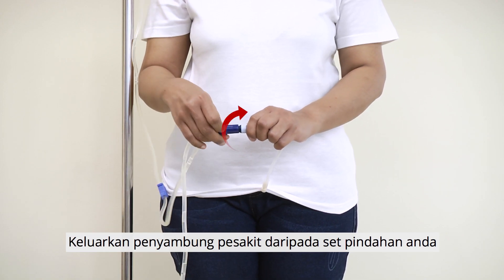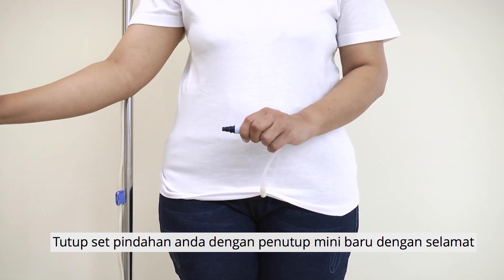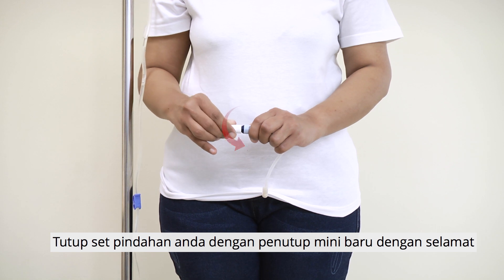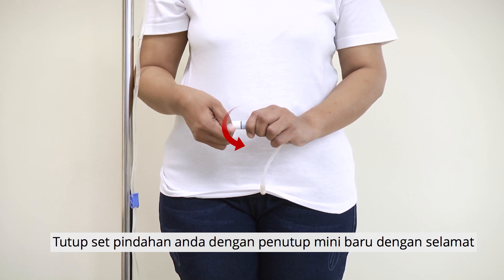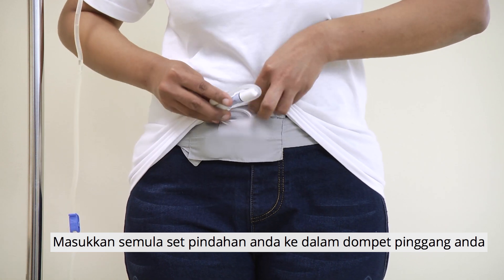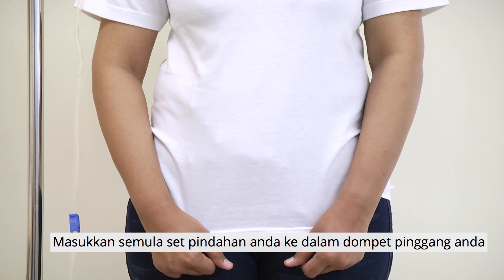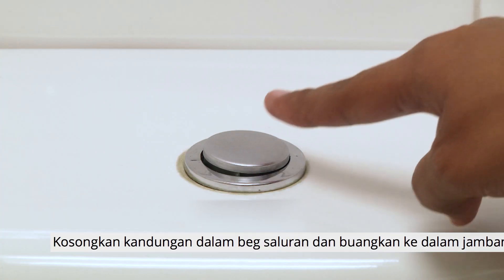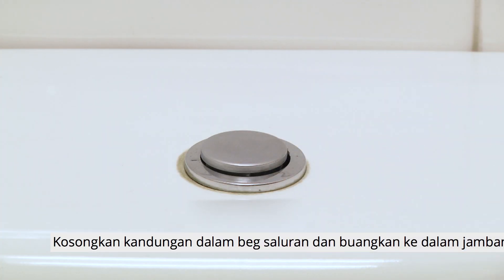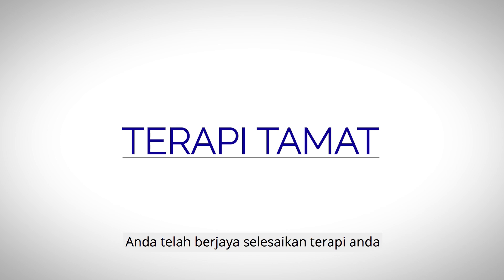Remove the patient connector from your transfer set. Close your transfer set with the new mini-cap securely. Put your transfer set back into your waste pouch. Empty the contents of the drain bag and flush it down the toilet. End of therapy. You have completed your therapy.